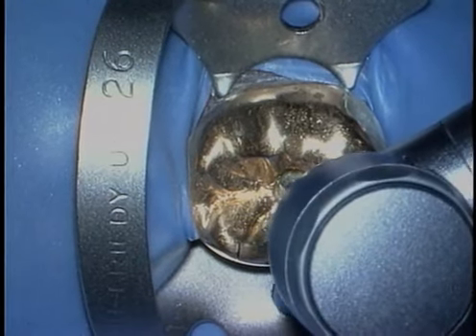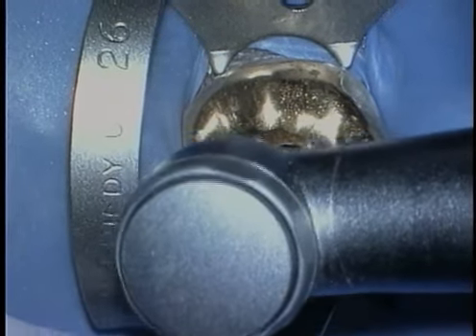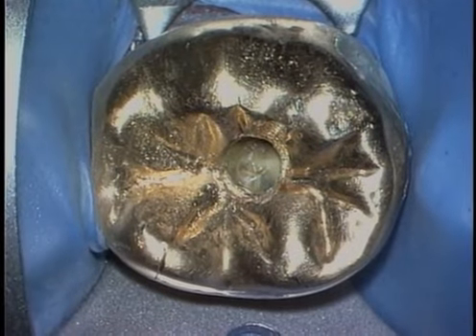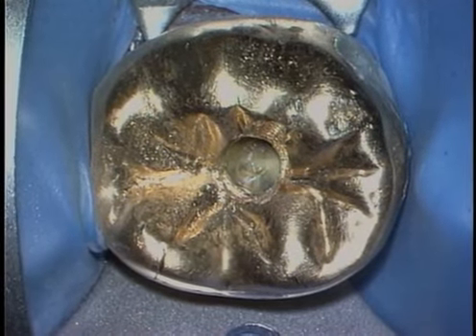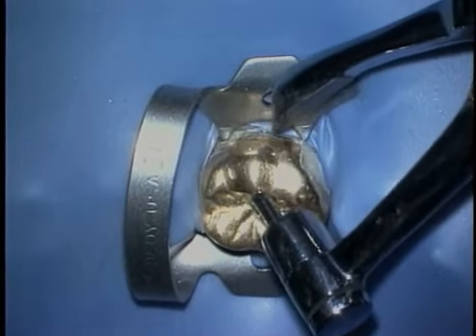The plier features an adjustable swivel pin which can be conveniently rotated depending on whether the removal effort will be conducted from the buccal or lingual aspect of the restoration. The swivel pin is inserted through the hole in the crown so that the removal forces are directed down the long axis of the tooth.